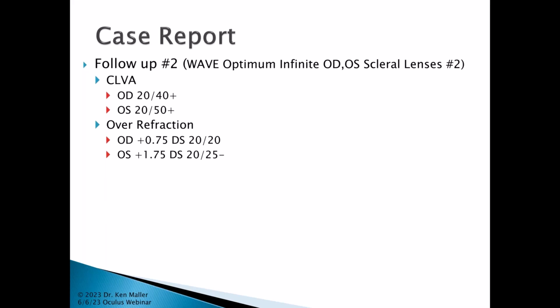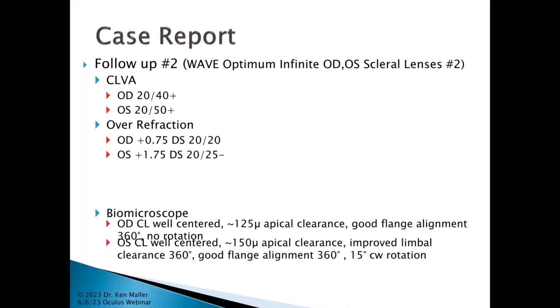We got the right eye to 20/20, and the left eye actually to 20/25 minus. I actually had given her a little too much minus. I had to dial that back a little bit to +1.75.